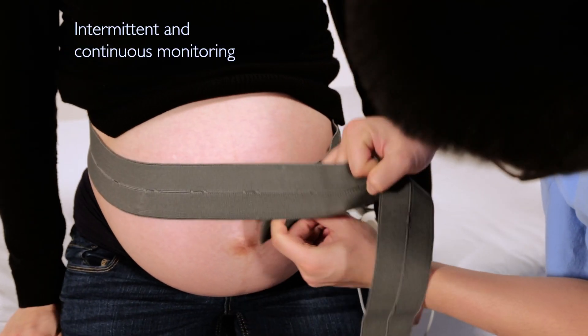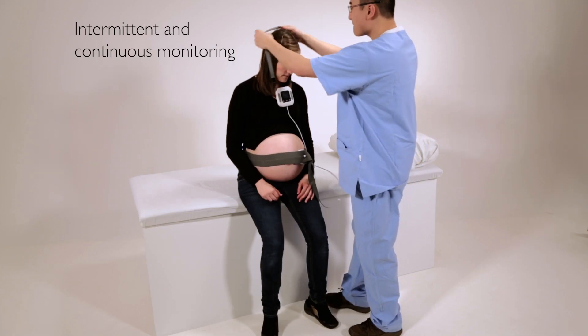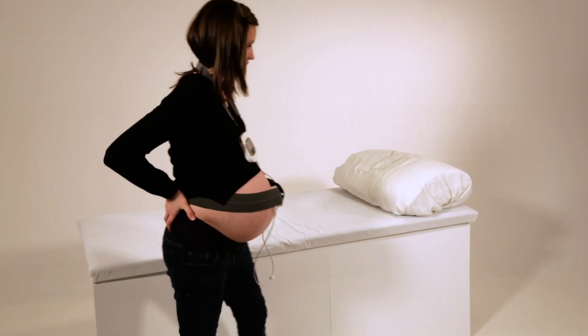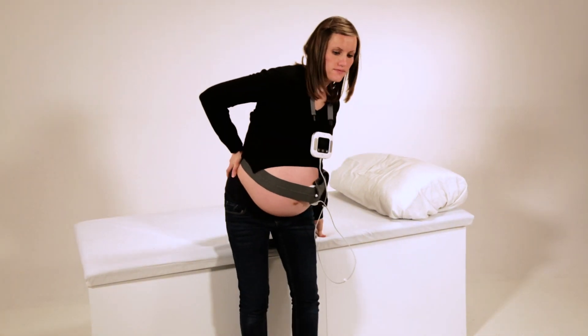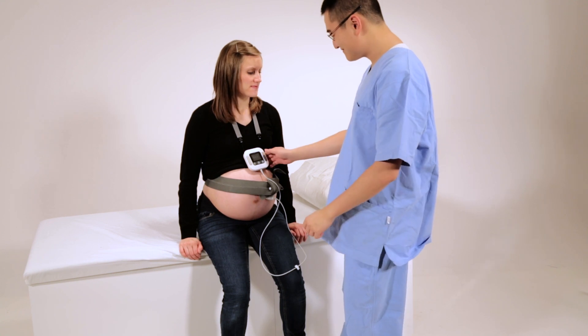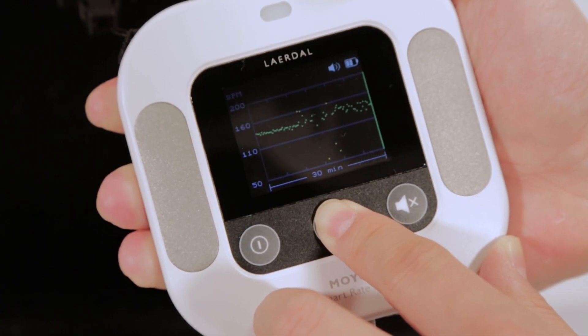Moyo can also be used for continuous monitoring. While wearing Moyo, mothers can continue to move around. Moyo can display the history of the fetal heart rate recorded in the last 30 minutes.